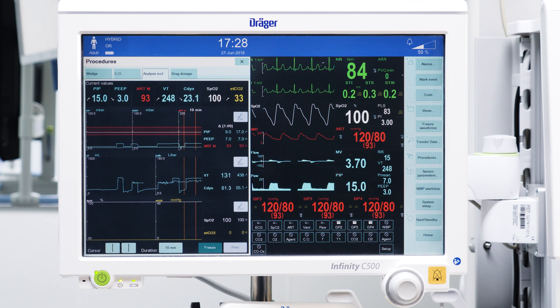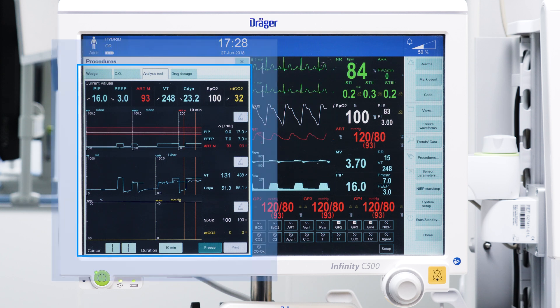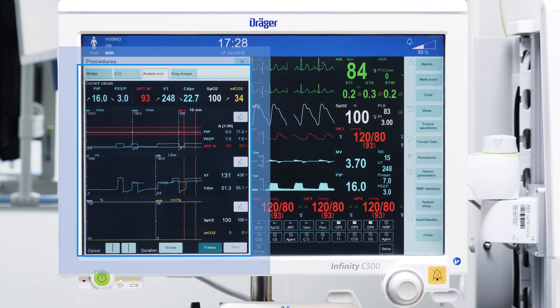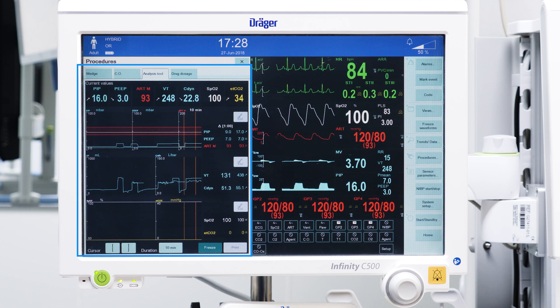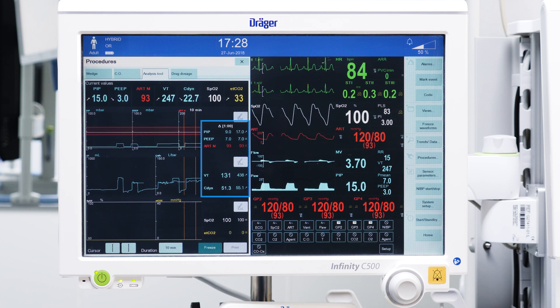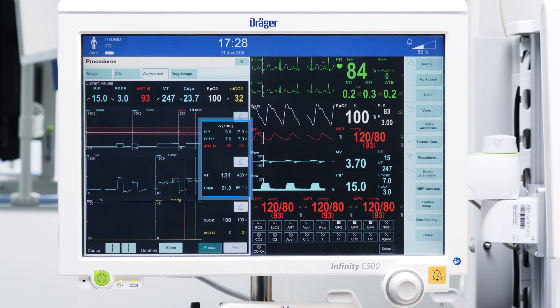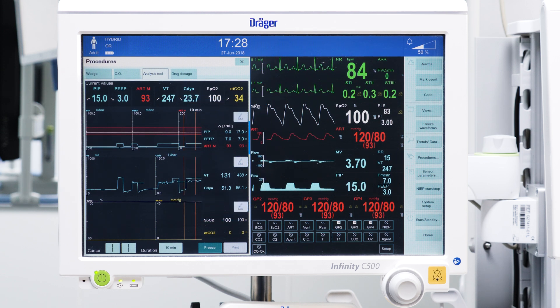Drager Infinity Acute Care System Patient Monitoring offers, in combination with Drager Anesthesia Devices, a dedicated analysis tool that displays relevant lung mechanics and hemodynamics parameters in parallel. Together with the indicators to assess the before and after situation, this system provides the clinician with confidence to evaluate the outcome of the recruitment manoeuvre.